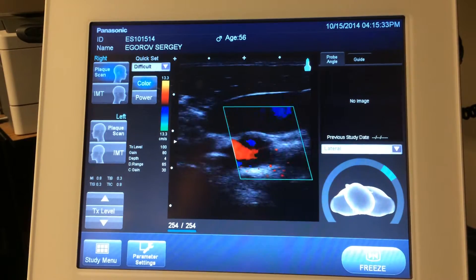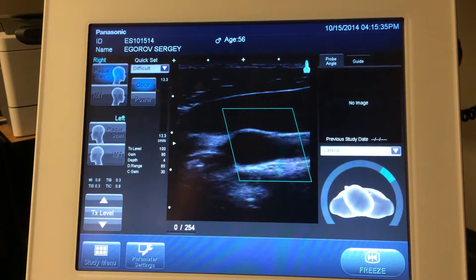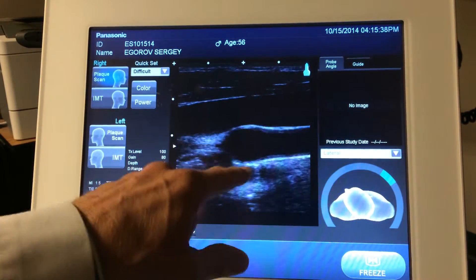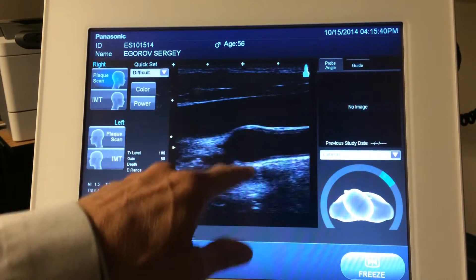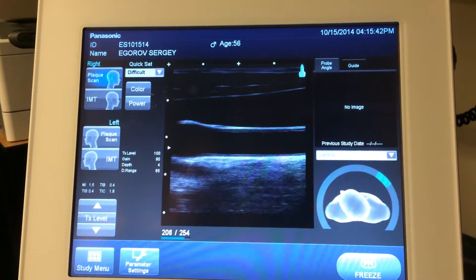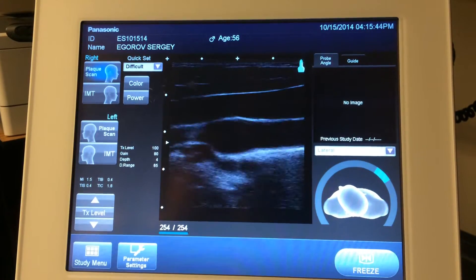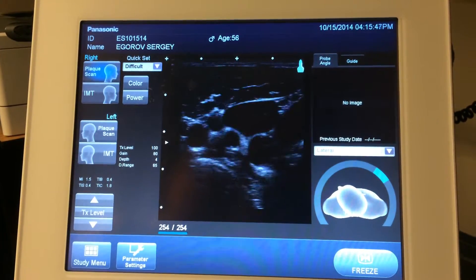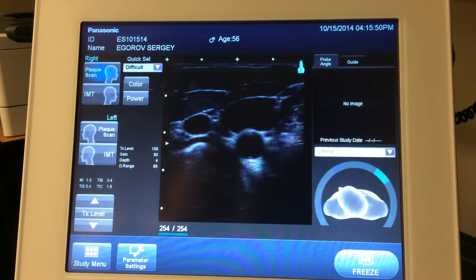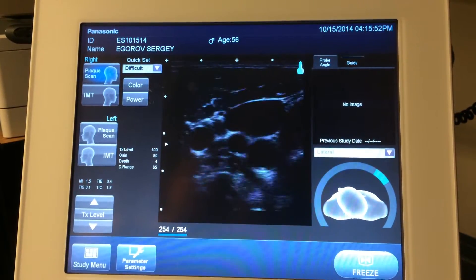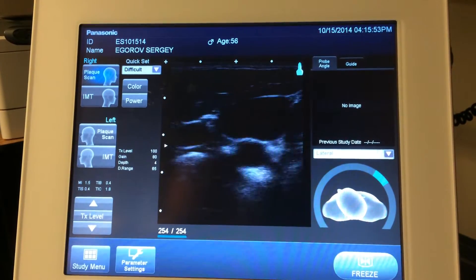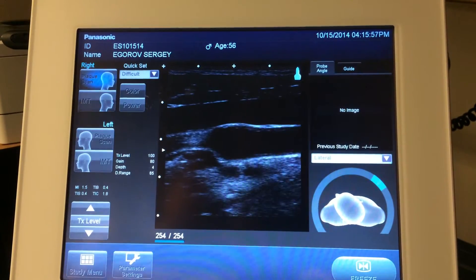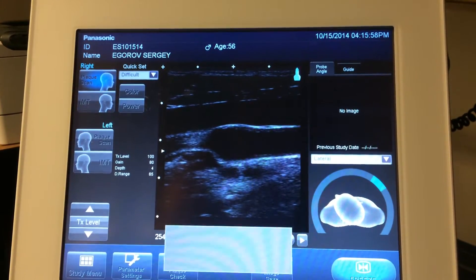So that all looks fine. Now we're going to turn the color off so we can take our measurements. Typically plaque starts at the bulb in this bifurcation point. You don't have any down here and you don't have any up in the bulb. It usually starts in the bulb and then spreads from there. But I don't see any evidence here of any plaque buildup. So we're just going to take a picture for the report and save that.